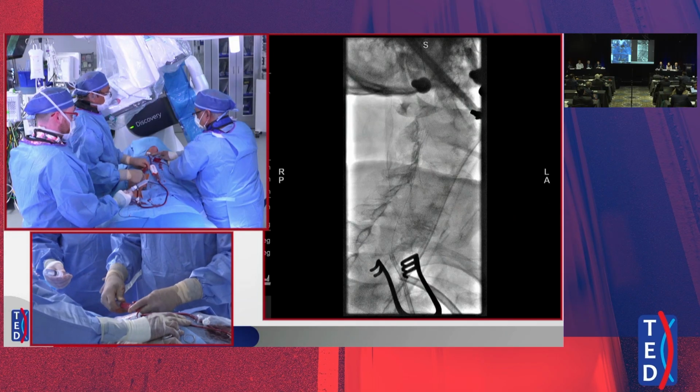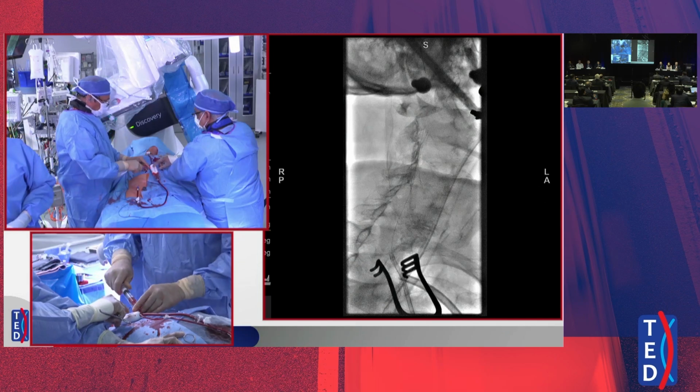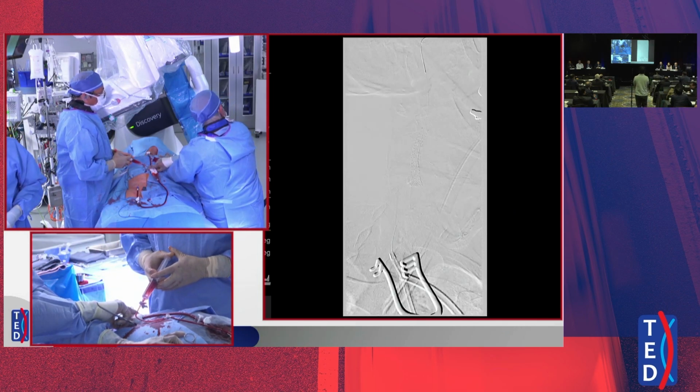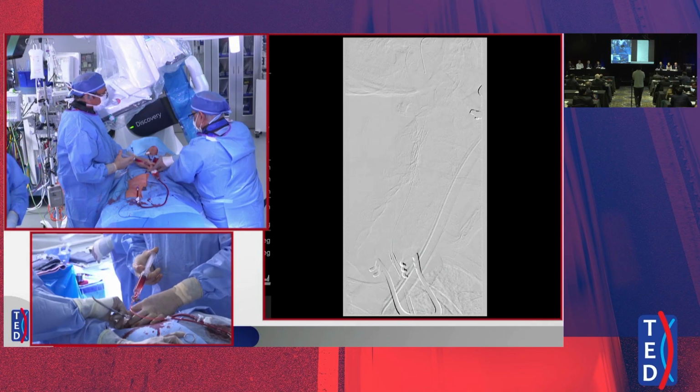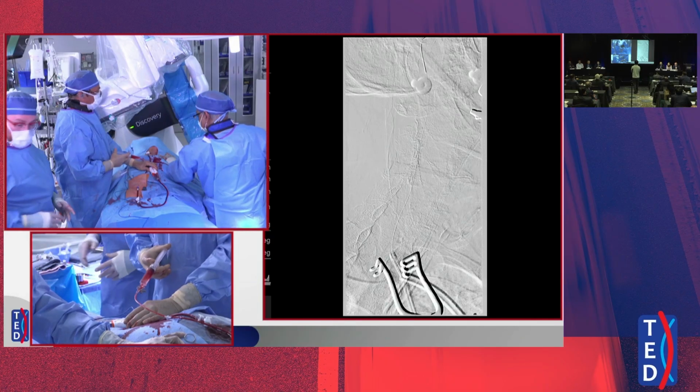Okay, let's take a picture and see whether we need to extend that into the common or just leave it for now. Saturation's all good, everything looks good. Okay, here we go. I'm shooting a good picture. Let's do it again. Someone did hit the table.